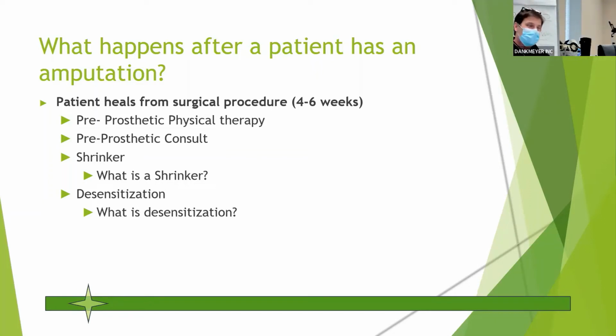So I would say clinically, you can use the AMP and just modify it for the kid based on the age. I know we had worked on a modified AMP for children a ways back with Michelle and some other people at Kennedy Krieger, but you don't need a validated outcome measure necessarily for a clinical justification. You can still use it as a test.